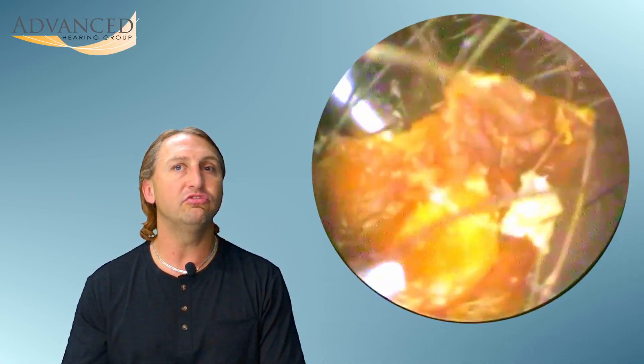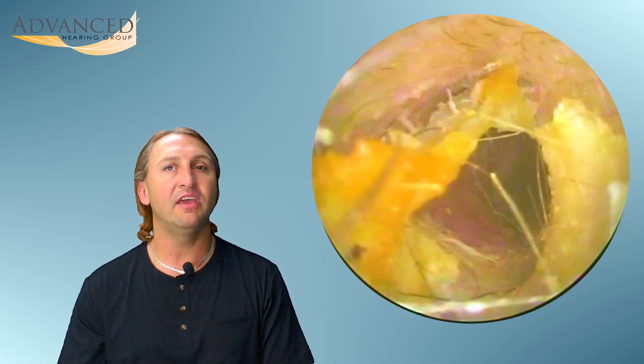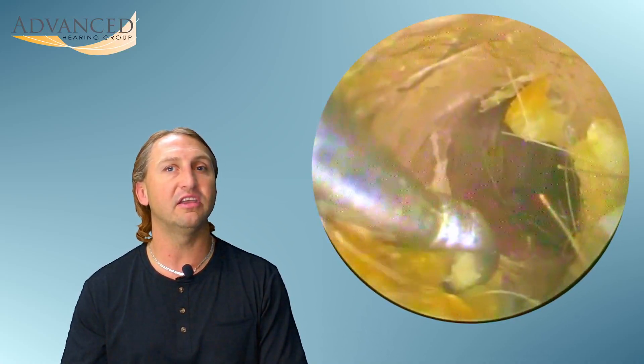This patient here was suffering from not so much the pain but definitely fullness and a little bit of ringing in the ears. Likely that ringing is due to hearing loss being caused by this big plug of earwax. We're going to get this out here nice and slow and then we'll have a good view of the eardrum.